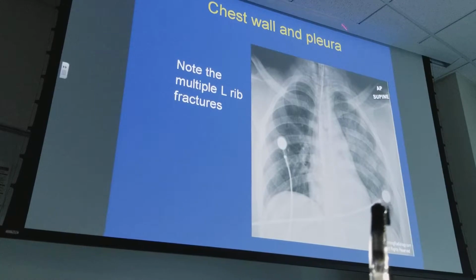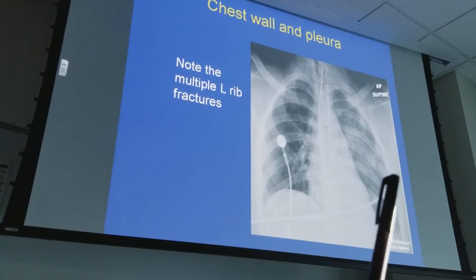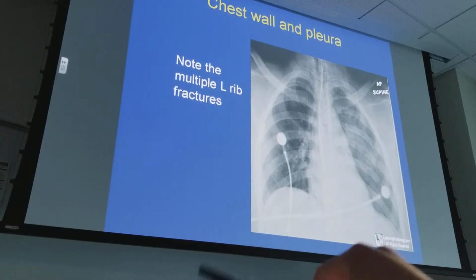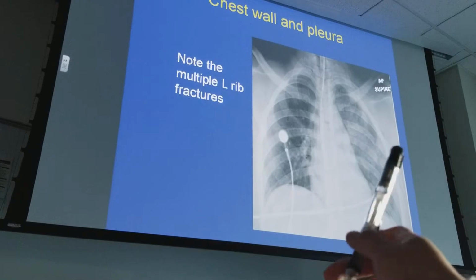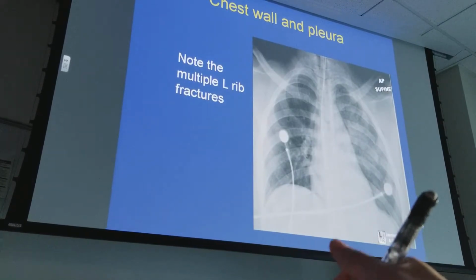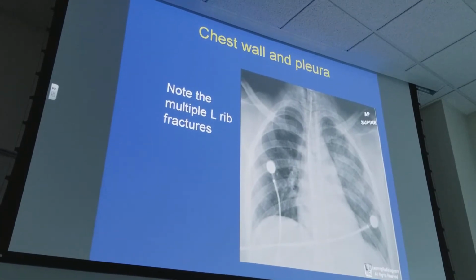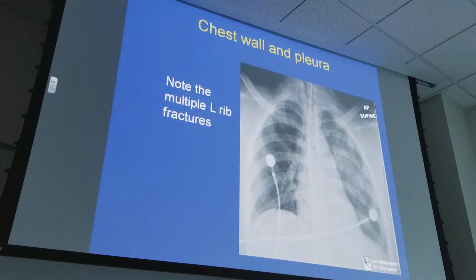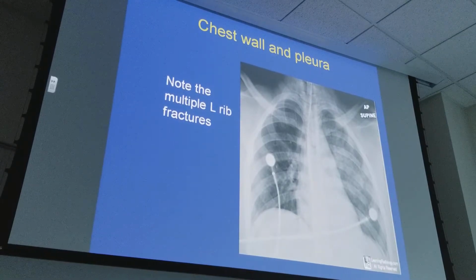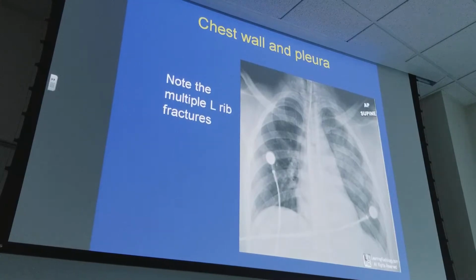So sometimes with X-rays, it's hard to see rib fractures. So if they suspect rib fractures, because maybe you had blunt chest trauma from a car accident or a motorcycle accident, they could do a rib series. The rib series is going to show the frontal, the anterior, and the posterior, and they put those 3 together, and they can see the entire rib cage and look for fractures there. Okay.